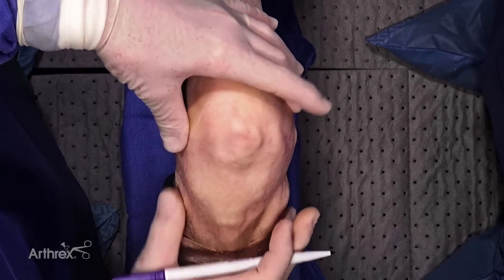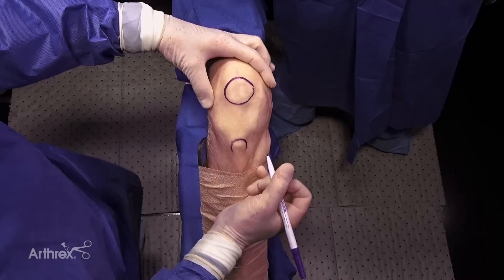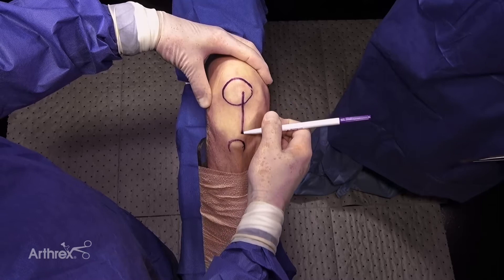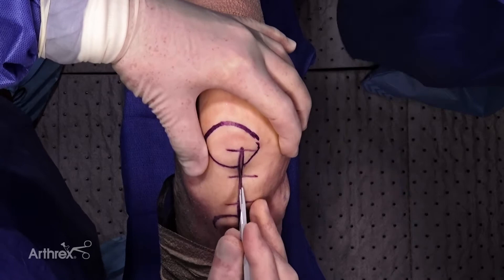Today we have a right knee, and we have the patella, femur, tibia, and fibula here. What I usually do to start the operation is draw out the patella with a sterile skin marker, draw out the tibial tubercle, and then pick a point one-third across the midpoint of the patella, and then the point on the medial aspect of the tibial tubercle. Then draw that line — usually it ends up being somewhere around 4 inches — and draw a couple of hash marks so my PA can re-approximate the skin. So then we make this incision.